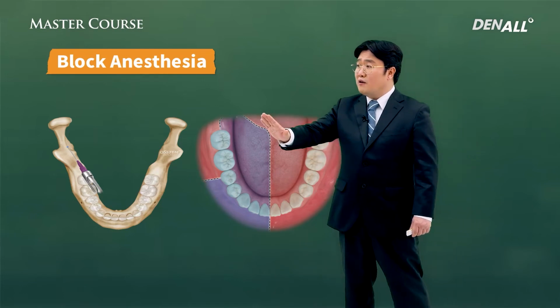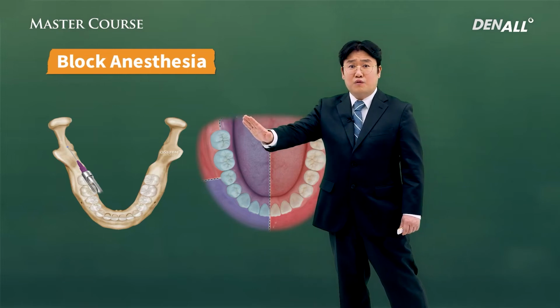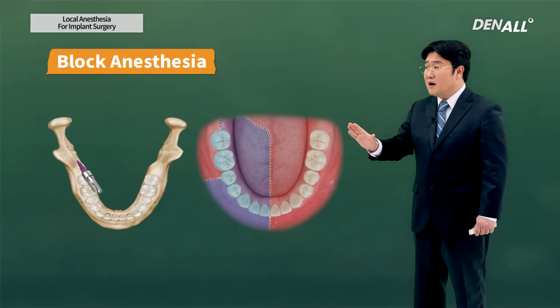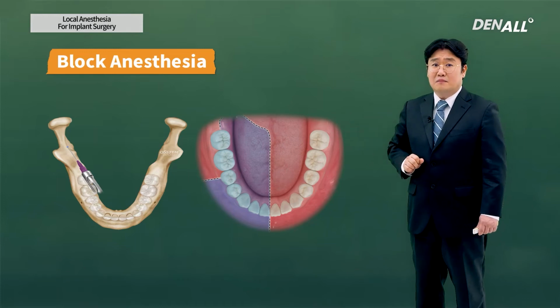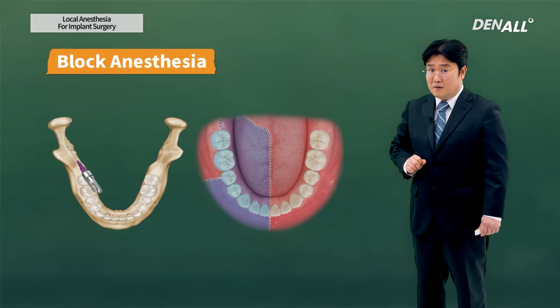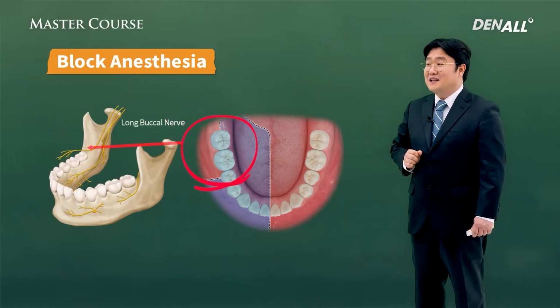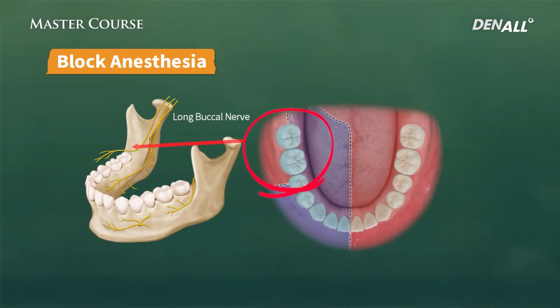And you may ask a question, what about the buccal mucosa of the molars? It's not under anesthesia. Why is that? The reason is the long buccal nerve is not blocked. The entry point of the injection needle should be put on the mucobuccal fold of the lowermost posterior tooth and inject 1/3 cartridge into the area.